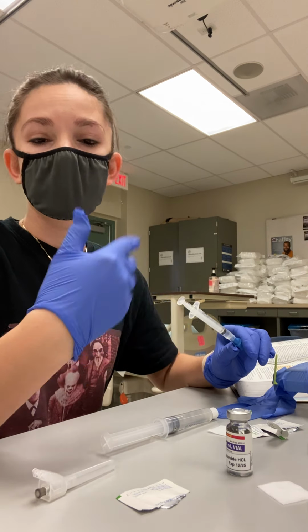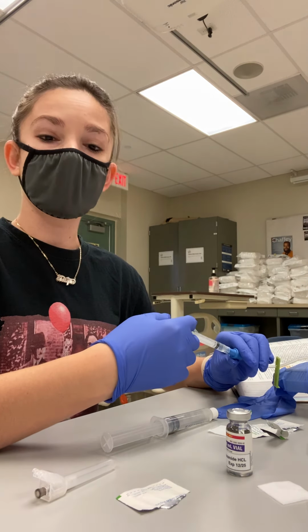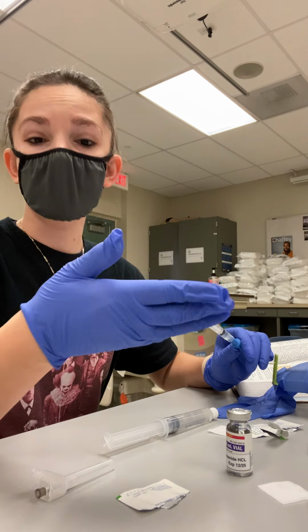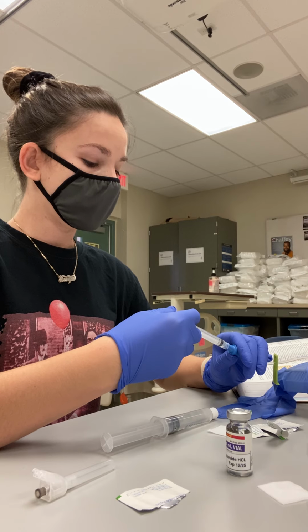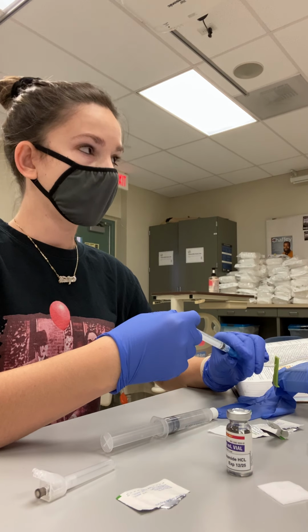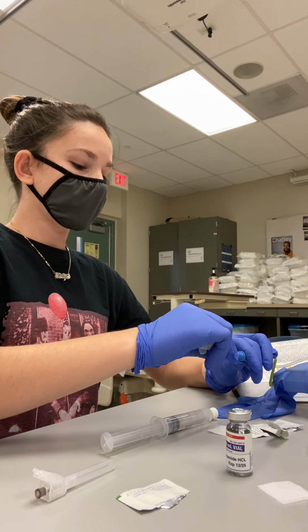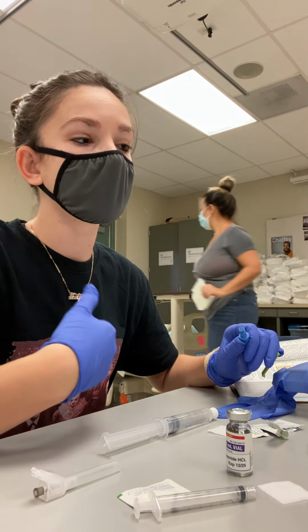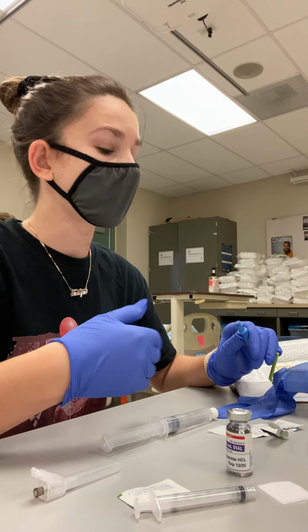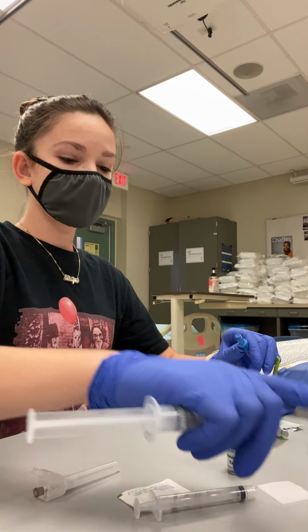So for the sake of demonstration, I've given it over 1 minute, and then I will give the other half over the second minute. Again, for the sake of demonstration, I've done it for 1 minute. Okay, and as you're administering the medication, you're talking to the patient, making sure that they are not having a reaction to the medication.